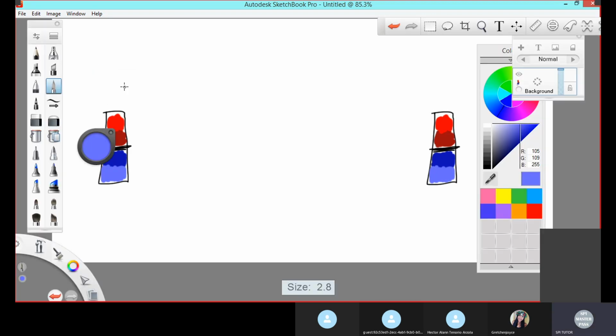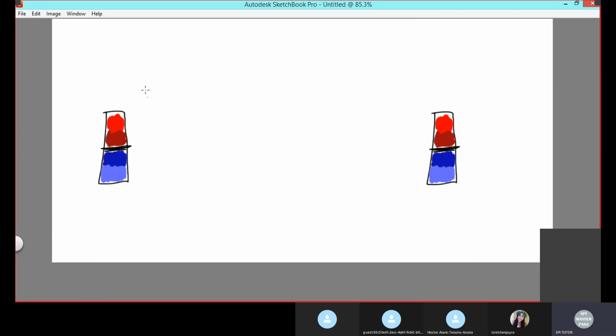Let's discuss velocity maps, or just color maps in general, because there are two. The first one is your velocity map. Your velocity map gives you velocities, okay? And velocities, remember, are a speed plus a direction. So they're going to give you a speed and they're going to give you a direction. That baseline separates your directions.